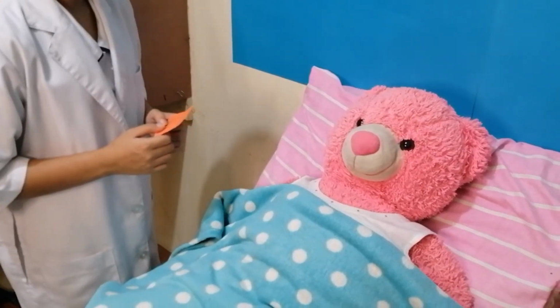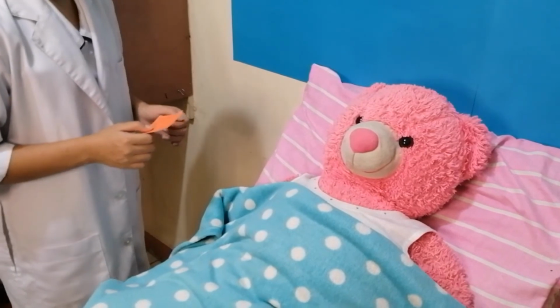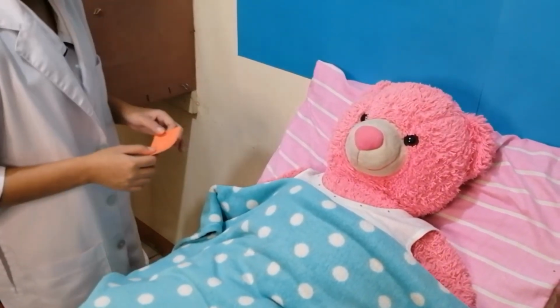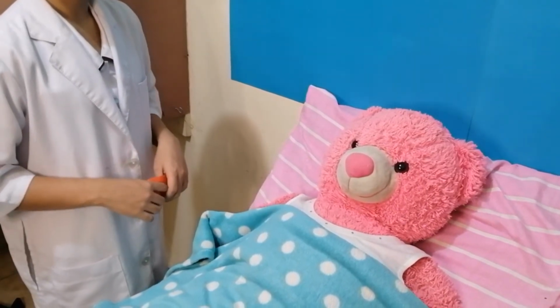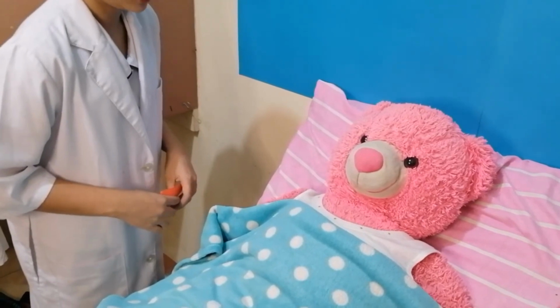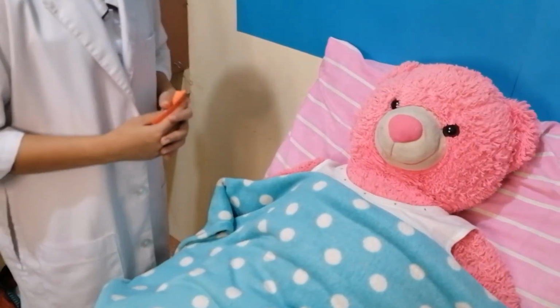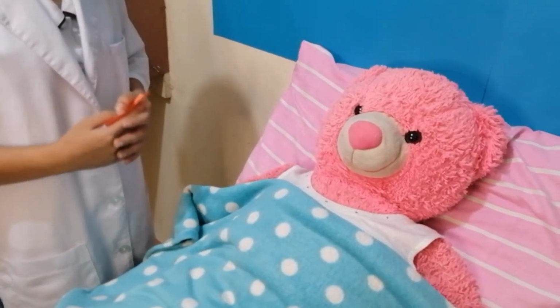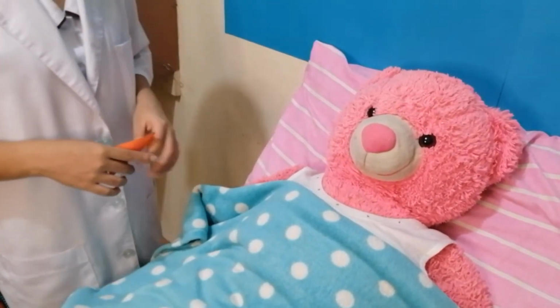Good day, sir. Is this Mr. Ramos? Can I check your ID band, sir? Okay. So, sir, I am going to remove an indwelling catheter, sir. Is it okay to you po? Okay, sir. In this procedure, you may feel a little bit of pain and discomfort, but you can tolerate it.